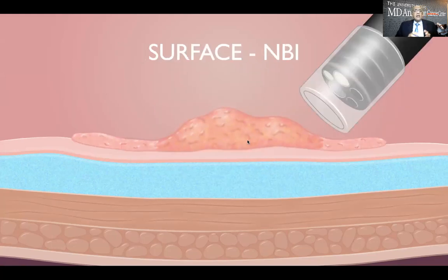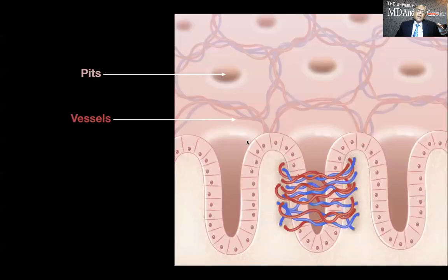So once you say that it is not cancer and you define the edge, and if there is a skirt lesion, you define that as well, then you focus on the surface of the polyp. Depending upon the endoscope you use, electronic chromoendoscopy, or if you are more comfortable, you could spray some indigo carmine to evaluate that further.